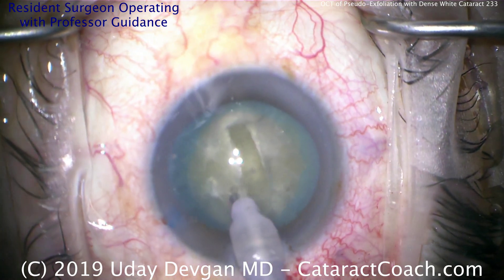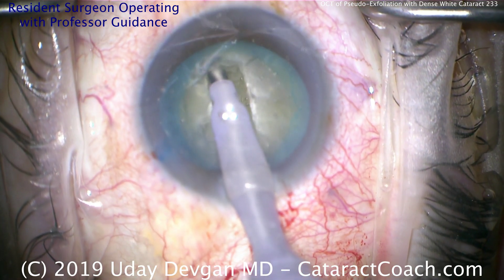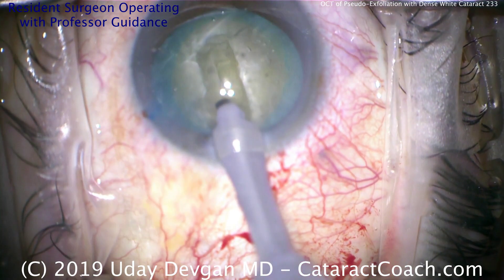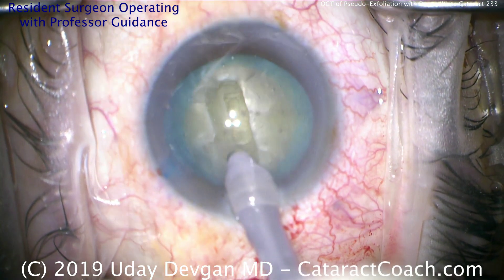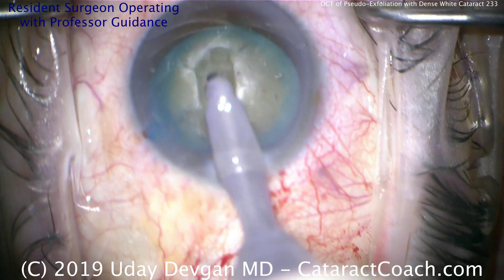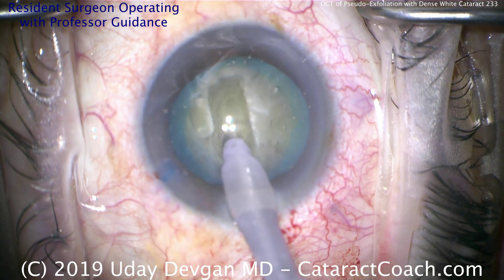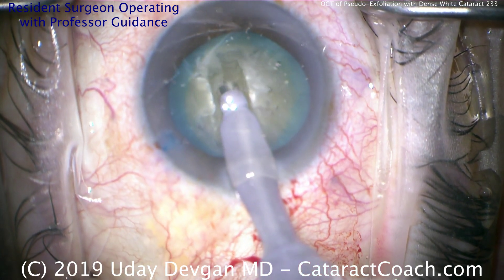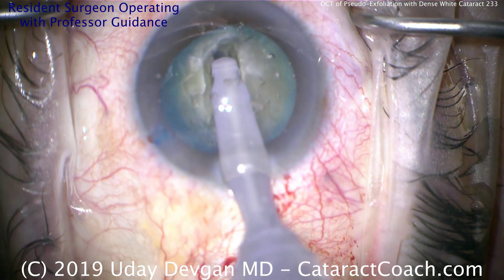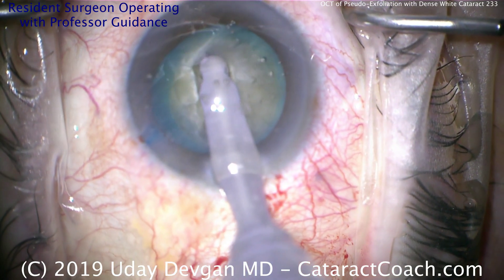So good grooves — nice, clean grooves. Here's widening of the groove. We want the groove a little bit deeper centrally and a little bit shallower in the periphery. Another good groove going down there. Once there's sufficient depth to the groove, we're going to crack the two halves apart. It's tougher to judge here because we don't have a red reflex given the nature of this dense white cataract. But because it has good nuclear density, it should propagate the cracks quite easily.